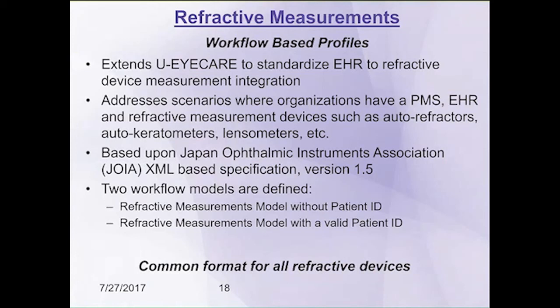In order to accomplish this, we really have 2 workflow models that are defined. One is where you incorporate the refractive measurements without the patient ID, and the other one with a valid patient ID. Now the reality is this is a connection between your EHR and your refractive devices.